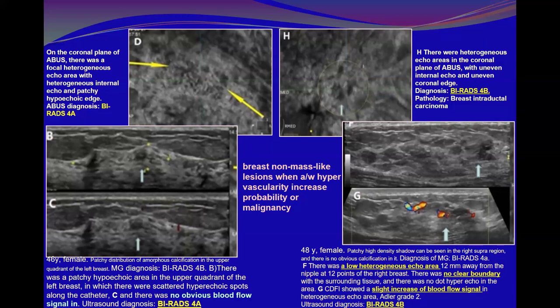It seemed to be a little bit segmental, while on the automated breast ultrasound it seemed more or less focal, perhaps because this is a coronal image and this is an axial image, in the upper outer quadrant of the breast. But there is no obvious associated vascularity and no more suspicious features, so it is borderline. It was graded as BI-RADS 4A, downgraded from 4B to 4A.